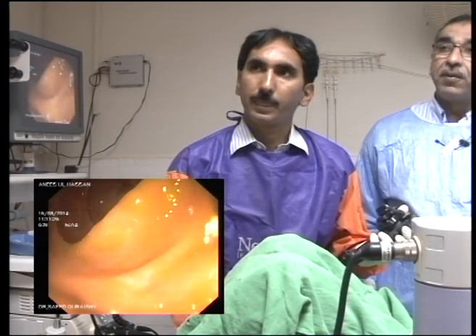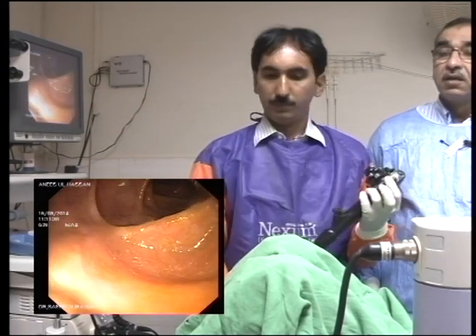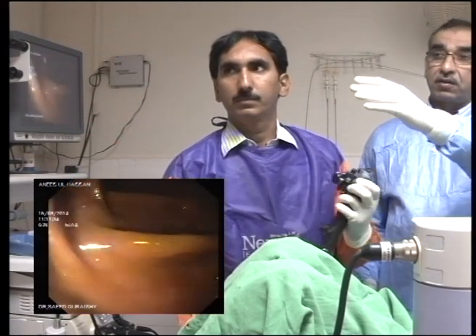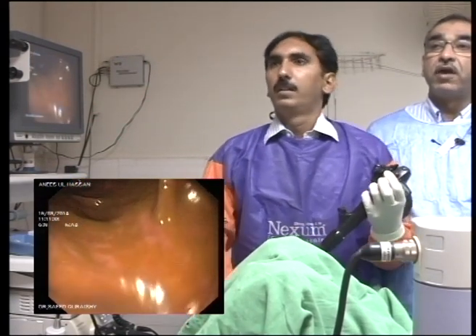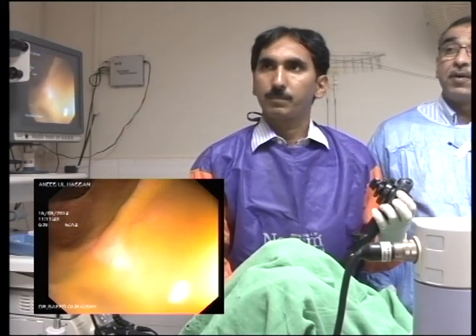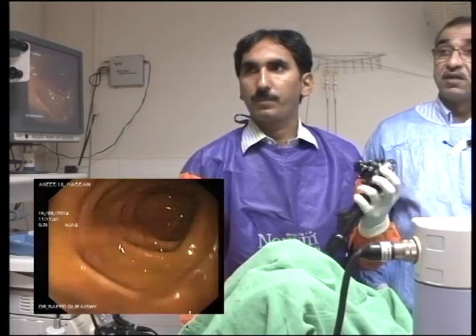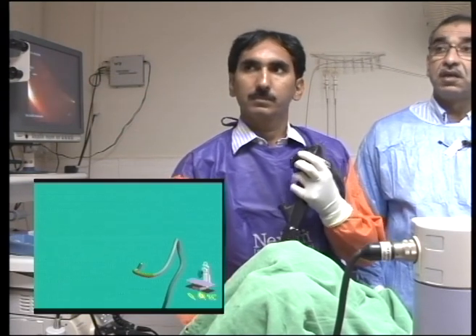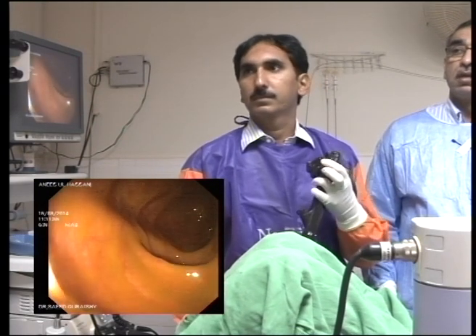Point up. Yes, well done. Good. Keep going. A little clockwise. And point up. Advance. Point up. Keep going. Just do a rotation, okay. Make a loop and you know. You can see the scope is very straight.